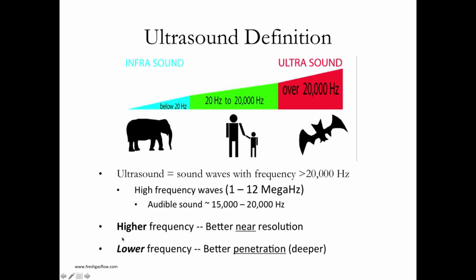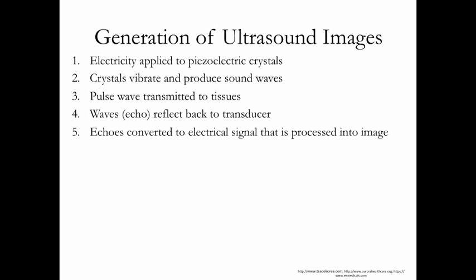Important to remember, and I'll come back to this, as you decide which probe you're going to use to image, the higher frequency probes will give you really good resolution, but don't penetrate really deeply. And so they're good for imaging superficial structures and good for imaging for real-time access in terms of vascular imaging. The lower frequency probes penetrate deeper, and so you can get visualization of deeper structures, but on the flip side, the resolution of the images that you get is not quite as good. And so it's important to balance the two as you decide which probe you want to pick up.